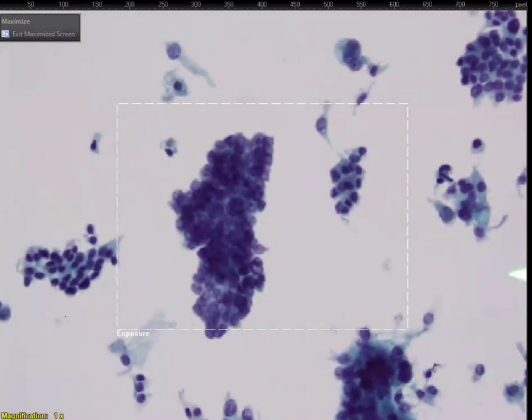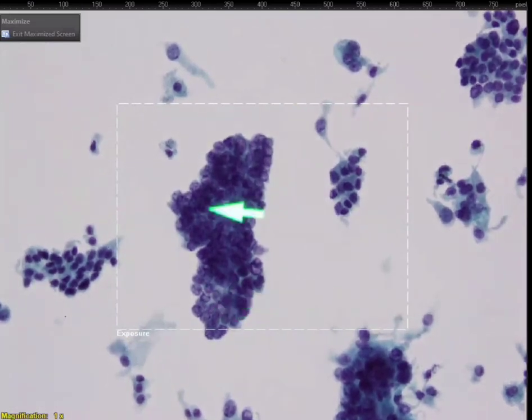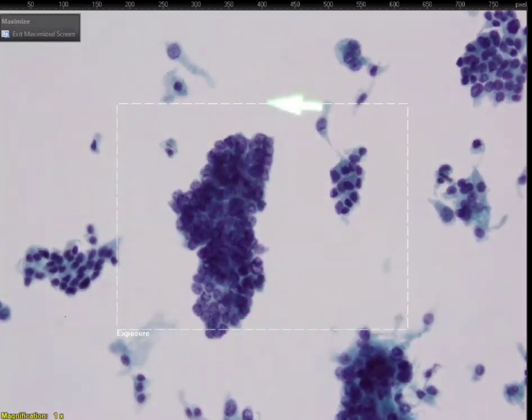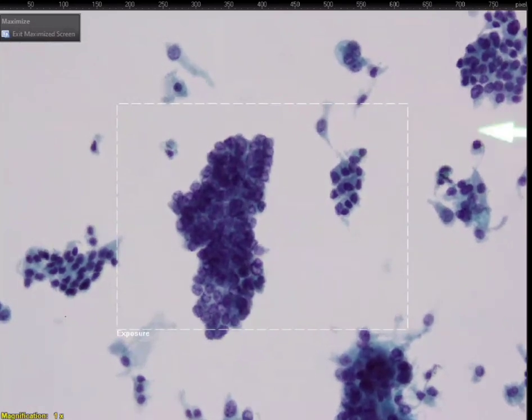No, these are again papillary. Papillary groove, groove clearing. You see a groove. Too many grooves. Inclusions are there, clearing. Oh my God, we nailed it. PTC. You see all the grooves here. Everybody see them? There are like a million grooves in this one group by itself.